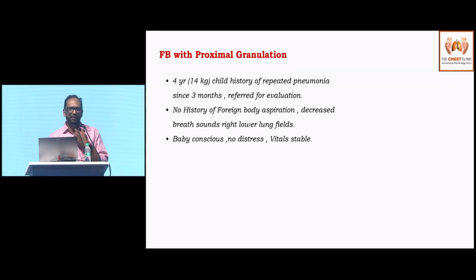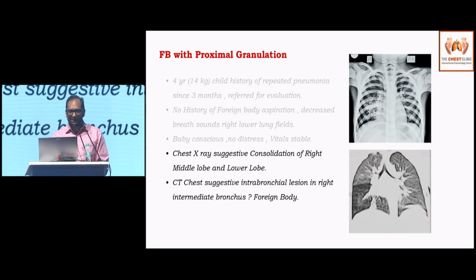So what if you have a foreign body with a proximal granulation? This is a 4-year-old child, chest X-ray, some consolidation.